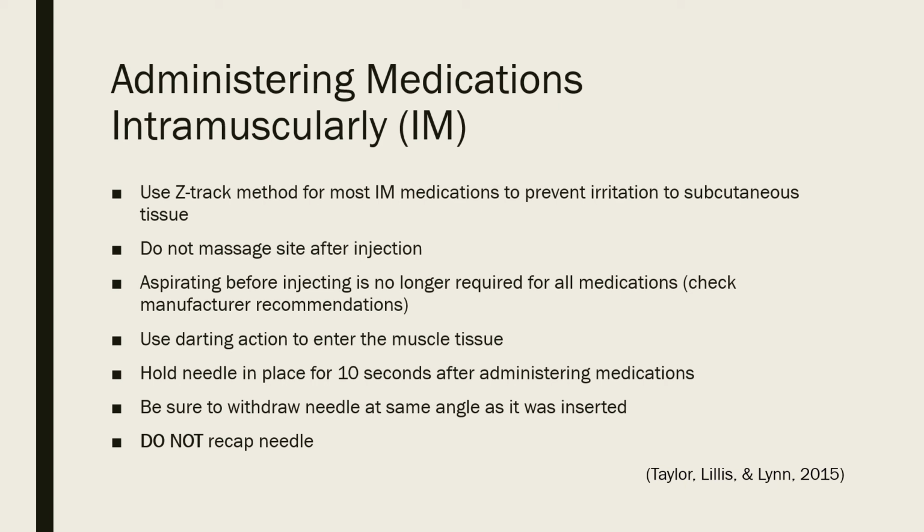You always want to use a darting action when you enter the muscle tissue. I've seen students, we talk about it before we go in the room. I'd say, now tell me how you're going to give this, and they're going to say, I'm going to use a darting action with my wrist. And then they get in there and they dart until they get right to the skin. And then I guess they get freaked out or something, and then they just push that needle in. And that's so painful for the patient. So you want to use that darting action to get that needle into the muscle.